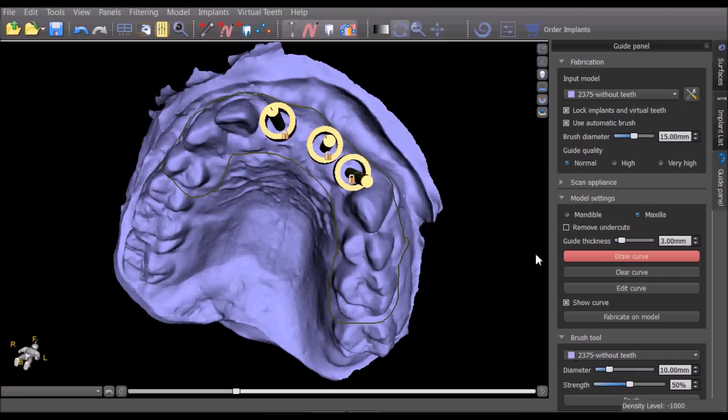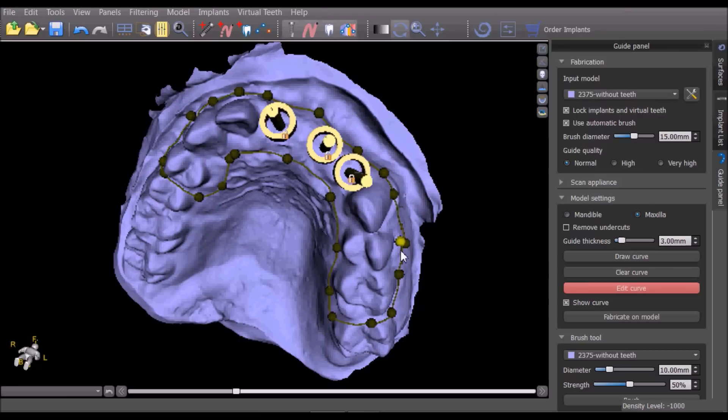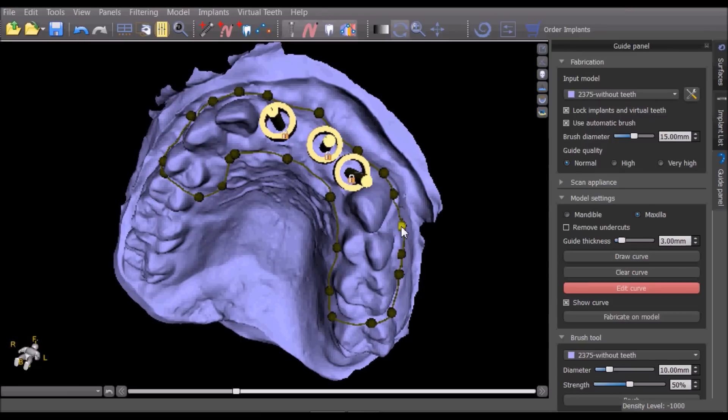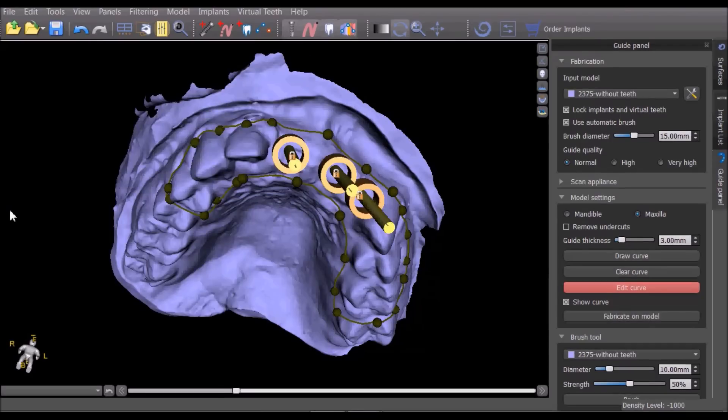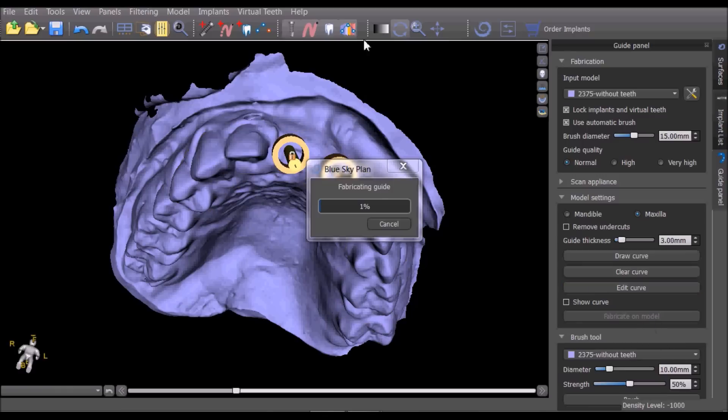Once the curve has been completed, select edit curve to fine tune the placement of the curve. Once the curve has been finalized, select fabricate on model to create the surgical guide.